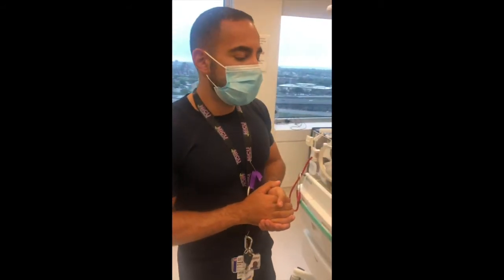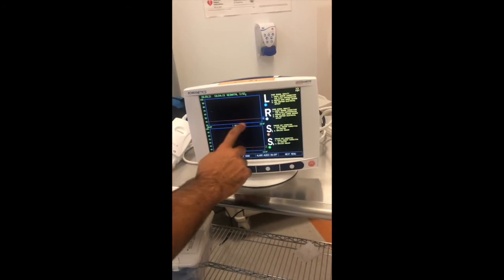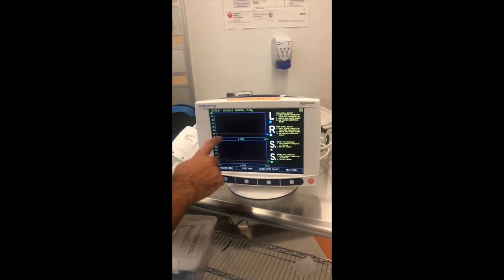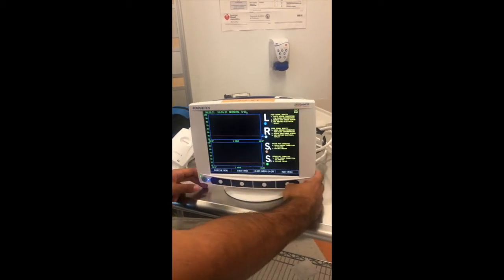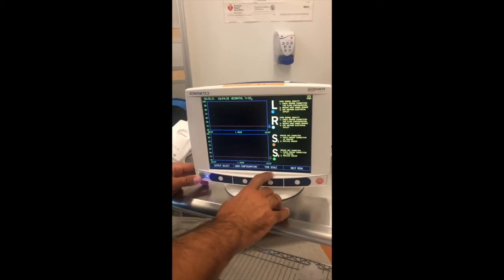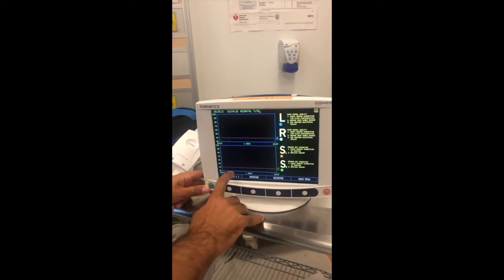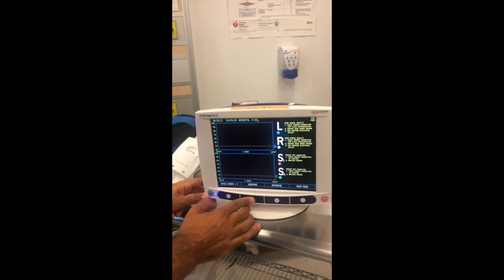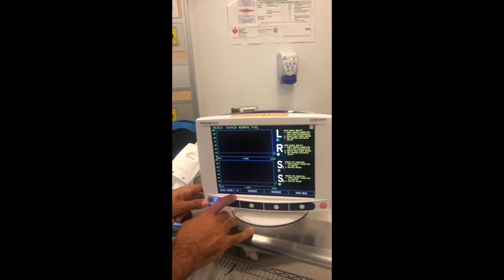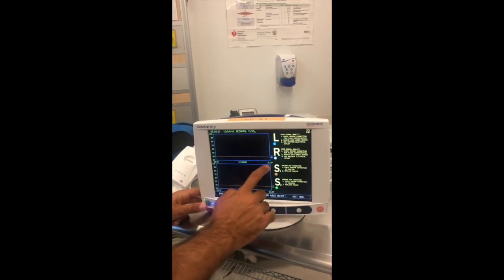Looking at the monitor, the trends are displayed over the course of one hour by default. You might want to view trends over a longer period. Go to next menu and select time scale. The scale is currently over one hour, but you can choose two hours, four hours, eight hours, or 12 hours. Once you've selected 12 hours, go back to the home screen and the scale changes to 12 hours, allowing you to see long-term trends.